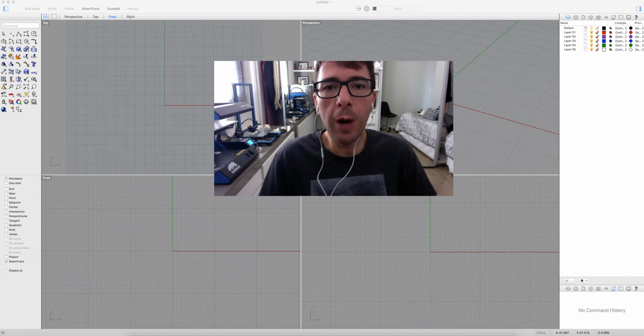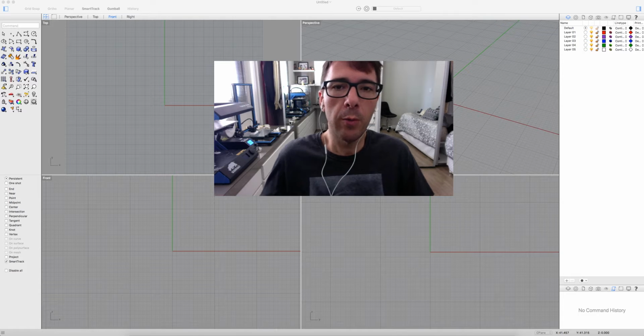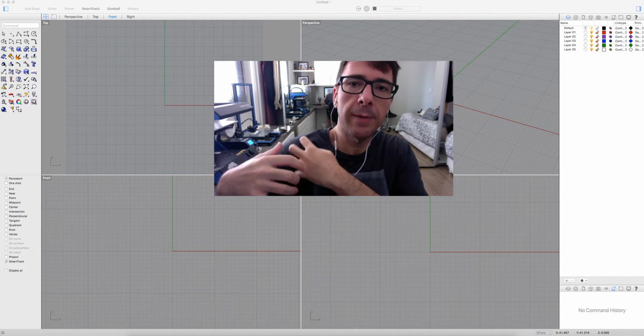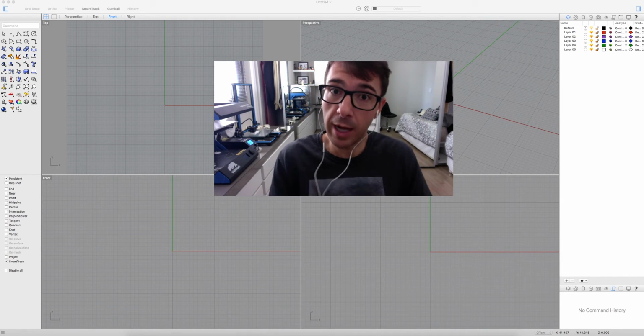We're going to show how we can draw, how we can design an implant. For this video we are going to show how we can design a reverse total shoulder arthroplasty implant. We are using the glenosphere, so only the scapular side, because the humerus is hard to draw.